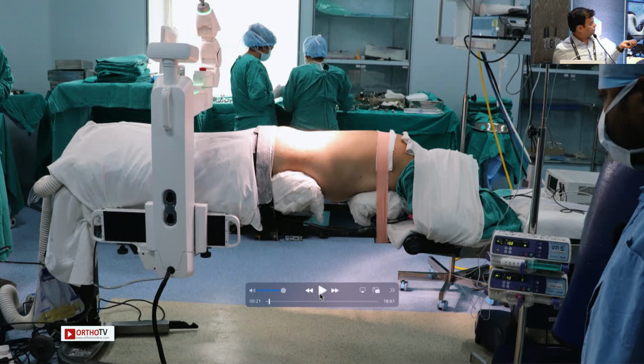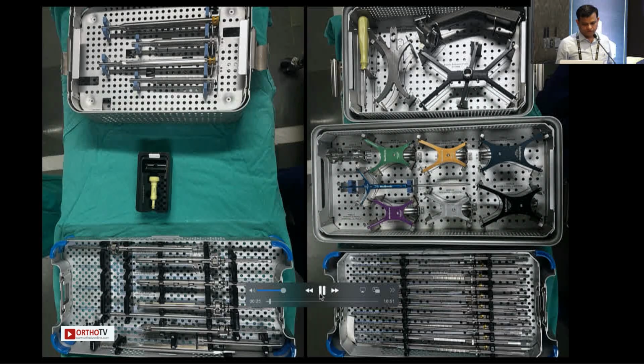And you can see that the patient is strapped very well so that you avoid any movement of the patient while you do the surgery. And so these are the instruments, more like navigation. These are all navigation trackers, and we will see the instruments one by one in future slides.